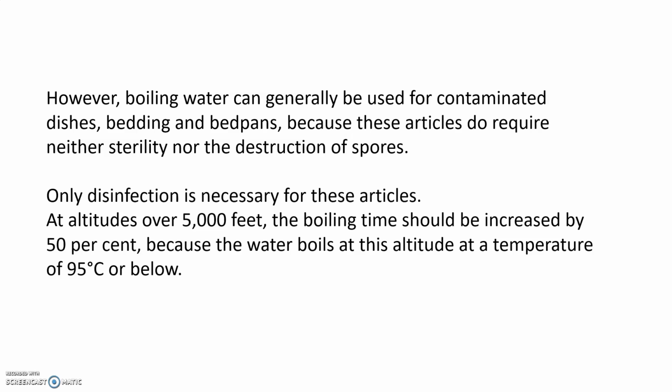Normally this boiling water procedure can be used for contaminated dishes, bedding and bedpans, because these articles don't require either sterility or the destruction of spores. Only disinfection is necessary for these articles.